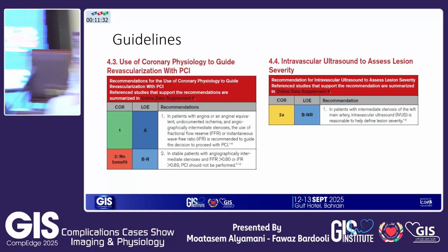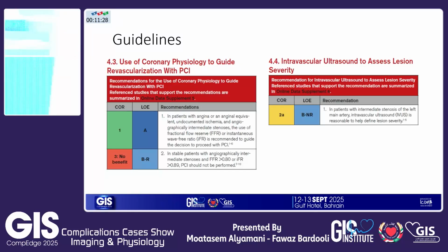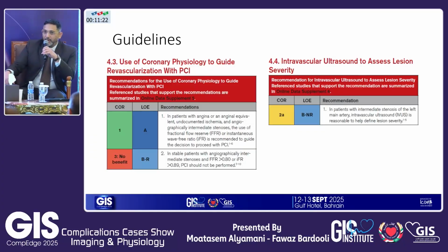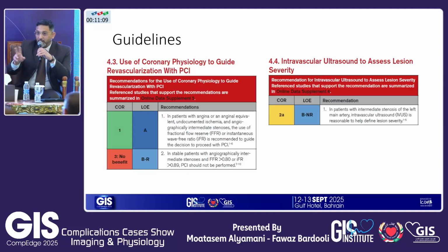Yes. So, coming to your point, actually, it's a great idea to do the FFR in both vessels. But as we know, FFR in LAD, it's not 1 + 1 = 2 in the left main. So you should always keep in mind that if the FFR into the LAD from the left main is positive, it may be negative in the circumflex. That does not mean that the left main is not significant or significant either way.